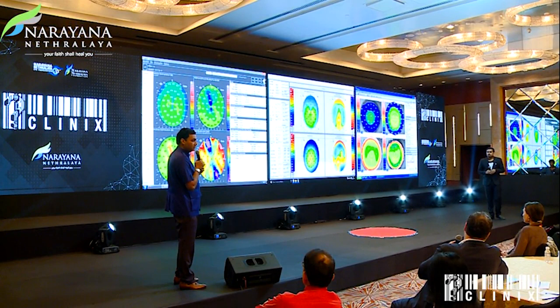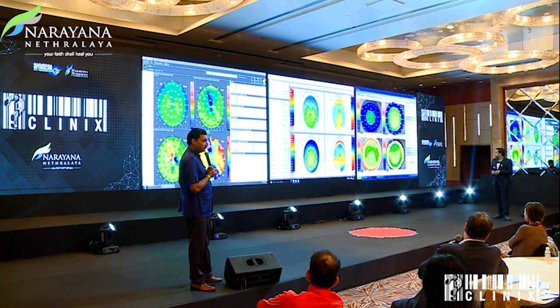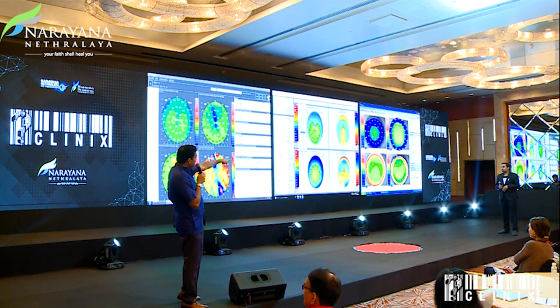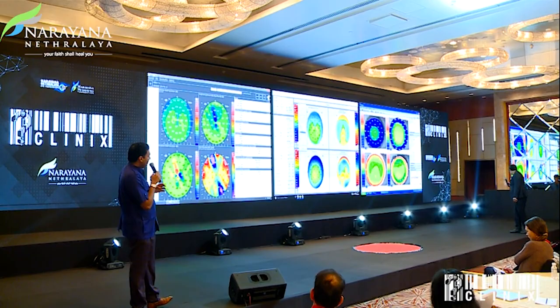If you have constantly changing scales, you can't interpret the map — you need a fixed scale that you are used to looking at. While we sort this out, what does the Cirrus show in the same patient? If you look at the Cirrus map, the main indices to look for are SIF, SIB, KVF, KVB, BCV, and the shape indices. One of the biggest challenges of Cirrus is remembering these terminologies; names like BCVF make the entire terminology very confusing.